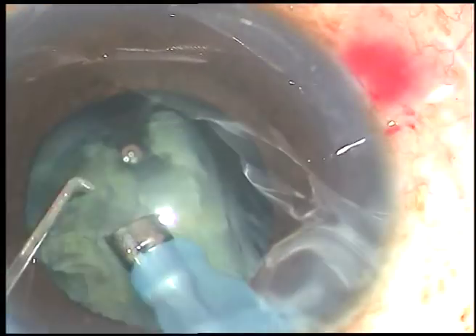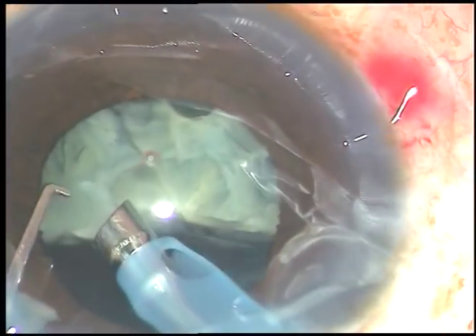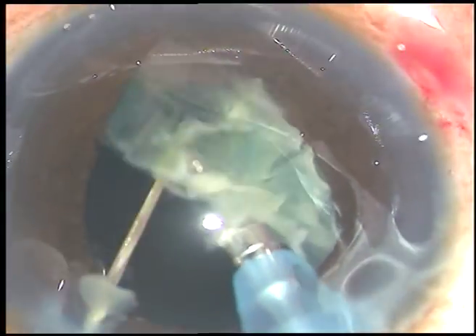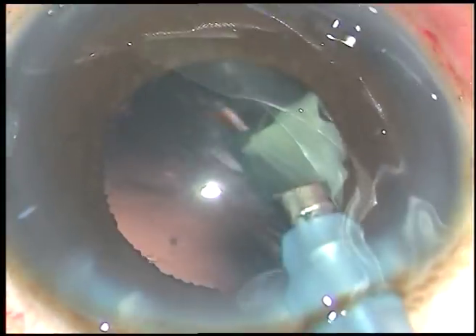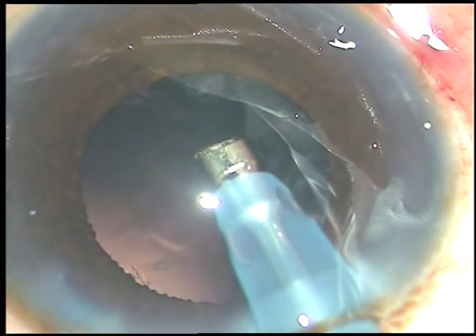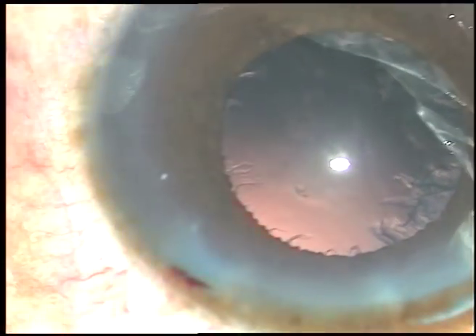I am taking care not to go under the iris. I am trying to remain at the center of the pupil, holding the nucleus with vacuum and chopping the nucleus into fragments. Then I emulsify the fragments and thus manage the nucleus. This is the last bit of nucleus — the chopper is removed so that the posterior capsule goes towards the vitreous cavity. And now some viscoelastic substance is injected.